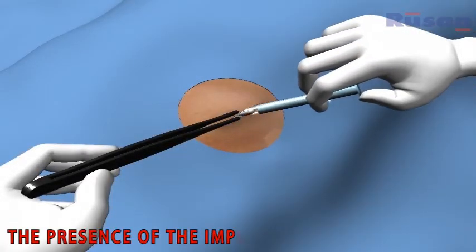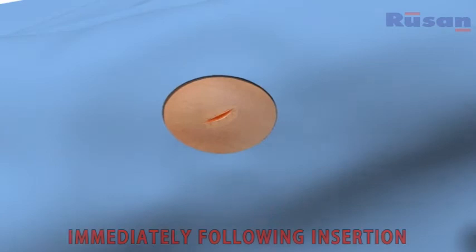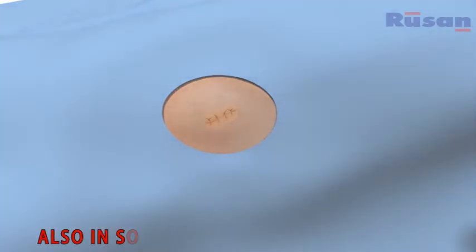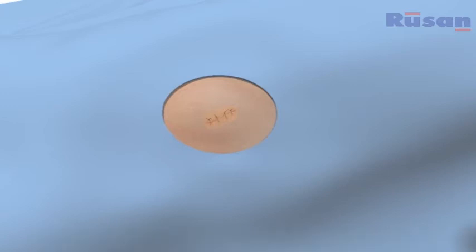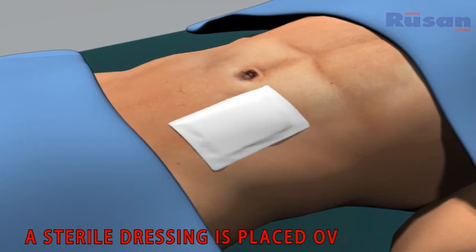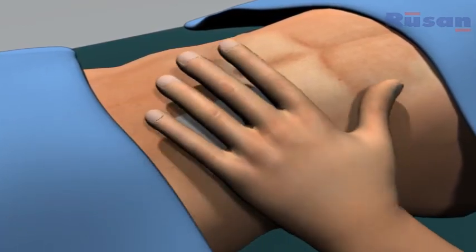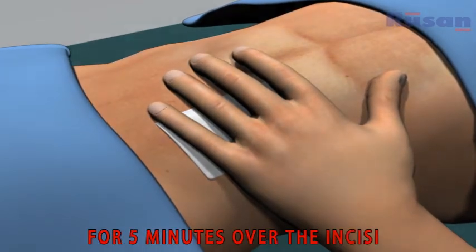The presence of the implant should be verified by feeling it immediately following the insertion. The incision is then closed using 3 to 4 stitches, also in some cases with cut-seal surgical glue. As a final step, a sterile dressing is placed over the area to reduce the risk of reactive bleeding. The patient is asked to apply mild pressure for 5 minutes over the incision.